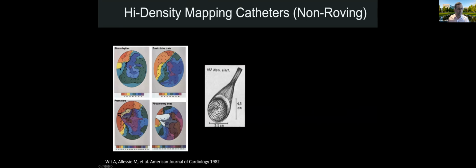As you can see on the left, the upper left is just activation during sinus rhythm. What do you see here in this isochronal mapping? Activation slowing, right? What we call today isochronal crowding. This was discovered in 1982, when we were still drinking milk from our moms. And if we put more and more extra stimulation at shorter coupling intervals, we can actually get reentry.